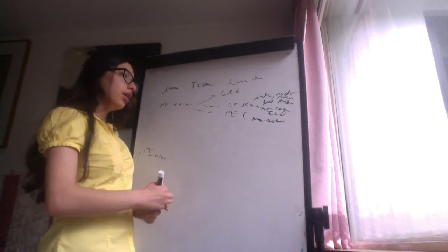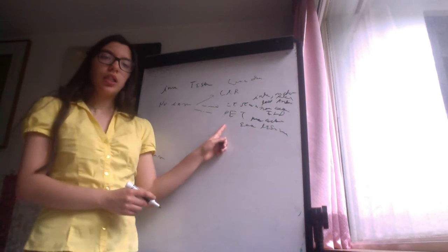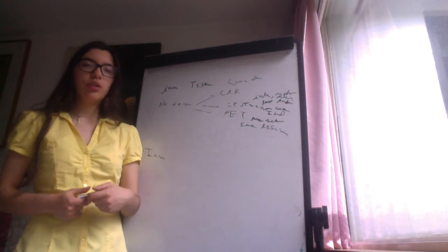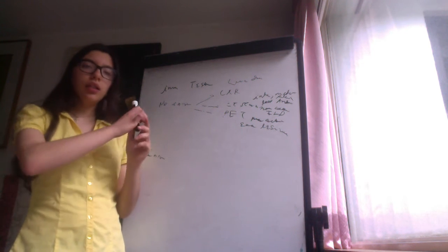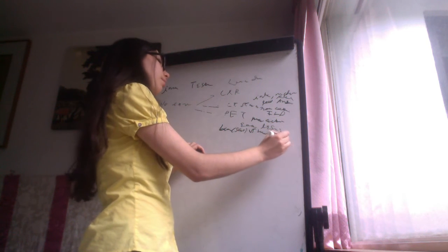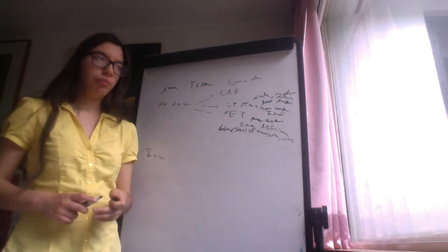This is an excellent test to detect early lesions, but if the lesion is very small, let's say a metabolically active nodule, sometimes we cannot see it in the PET scan, so it's not very recommended in small lesions. The other thing is that it's excellent in distinguishing benign lesions, for example, scar tissue, versus malignant lesions. But between malignant, infectious, and inflammatory lesions, the PET cannot distinguish.